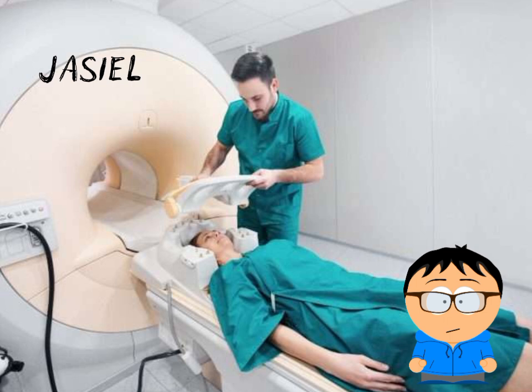Magnet, which generates the magnetic field needed for magnetic resonance imaging. This can be a permanent magnet or electromagnetic coils. 2. Coils, devices that transmit and receive radio signals. There are different types of coils, such as surface coils and body coils.